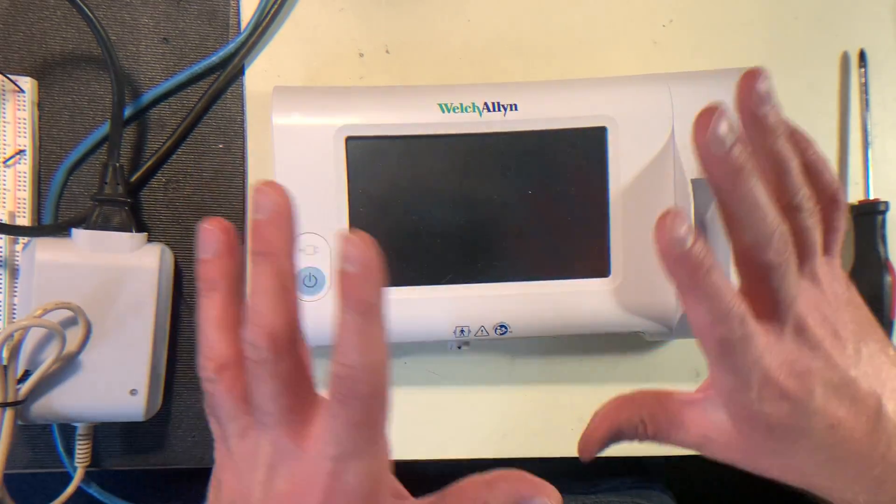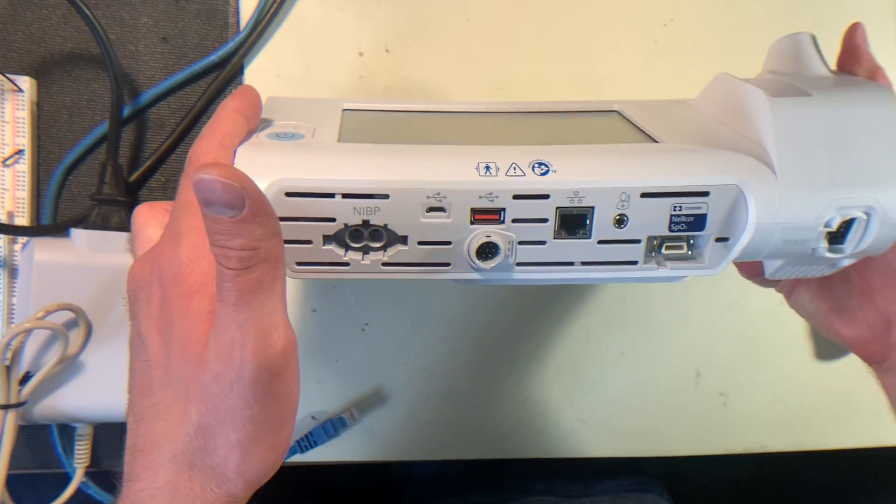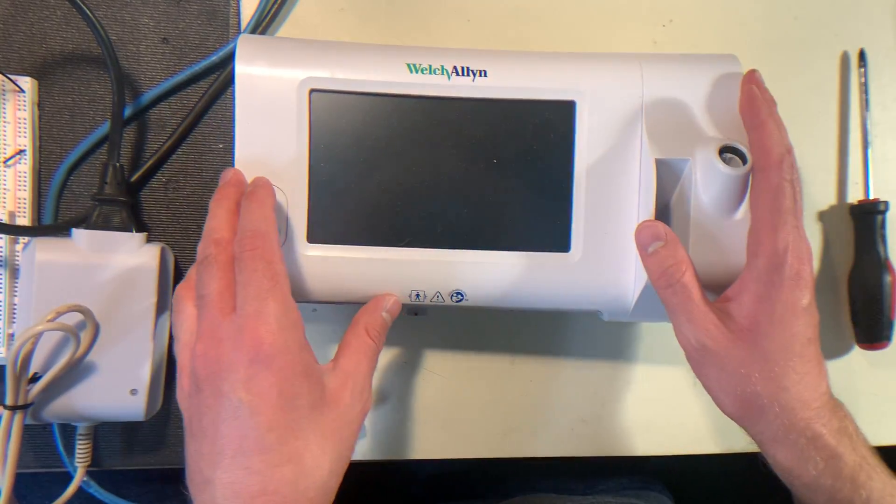In this video I want to give a quick overview of the Welch Allyn, the different components of it, different ports, and just basic user interface stuff.